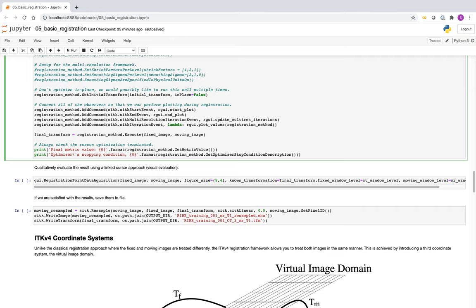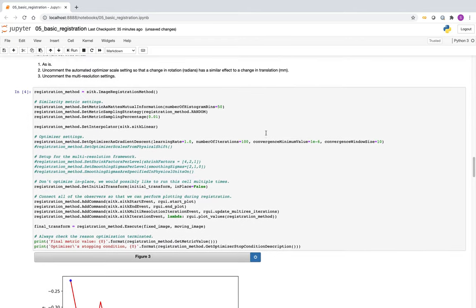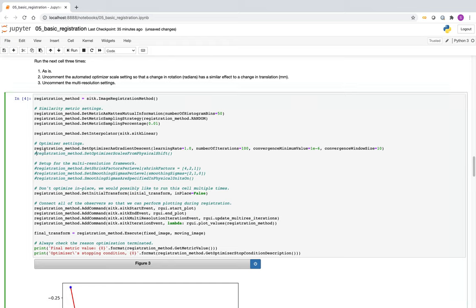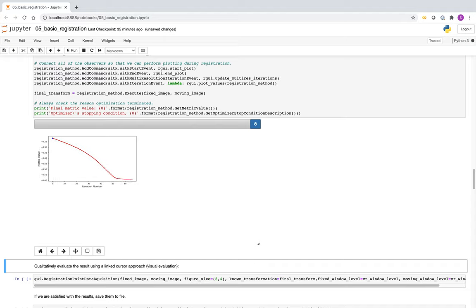Running it: this does not look good. It did not behave well — it was not converging, just bumping along. That is most likely because we didn't scale things correctly. Don't forget to auto-scale the non-commensurate parameters. With auto-scaling enabled, this looks much better — we're converging.